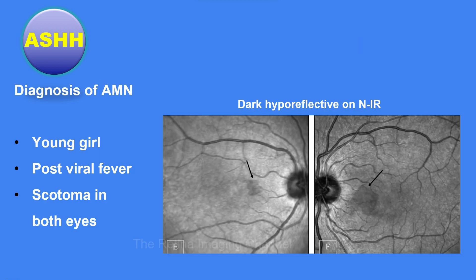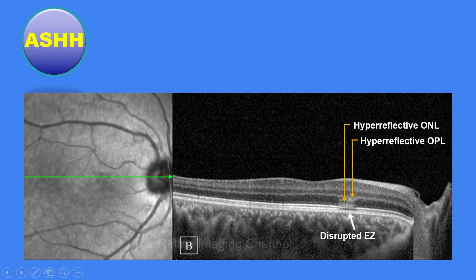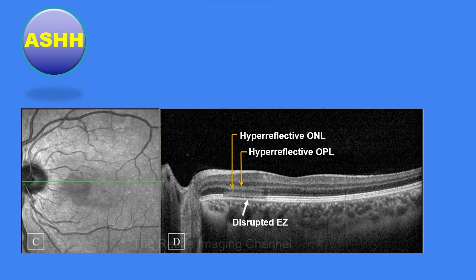Let us see another example of ASHH in a case of AMN. These are the infrared images of the right and left eyes of a young girl who complained of scotoma after recovering from viral fever. The hyporeflective dark patches nasal to the fovea, marked by black arrows, are suggestive of AMN in this clinical scenario. The diagnosis is further substantiated by ASHH in both eyes: the right eye shows hyperreflective OPL and ONL with disruption of the ellipsoid zone, and similar findings are seen in the left eye. This is a classical case of AMN with ASHH.